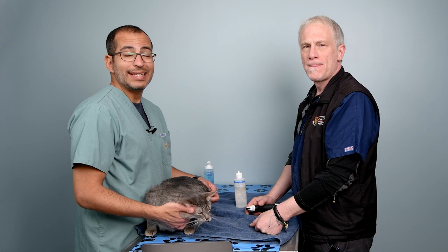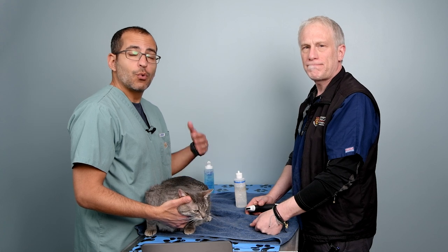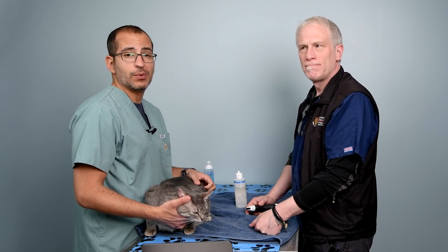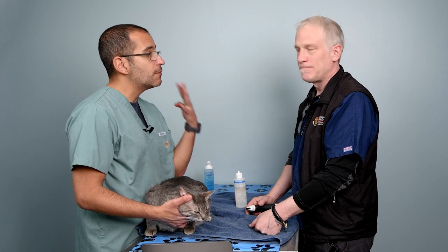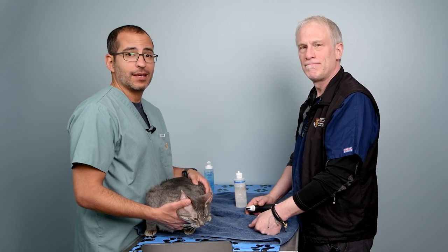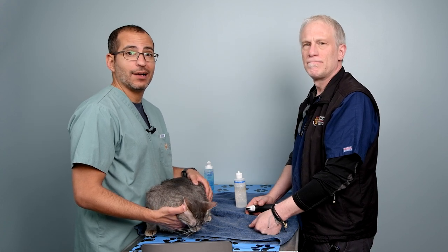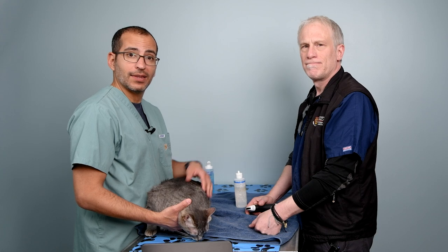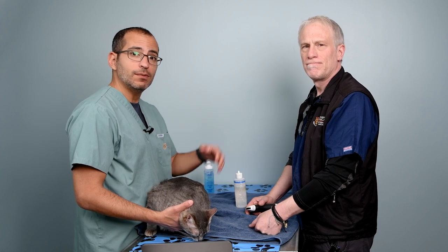Now we're going to go through each question individually. There are actually four pathologies that we look for when we do pleural space and lung ultrasound — just four pathologies. We're going to come back to them in detail after this. Until then, merci beaucoup. Au revoir.